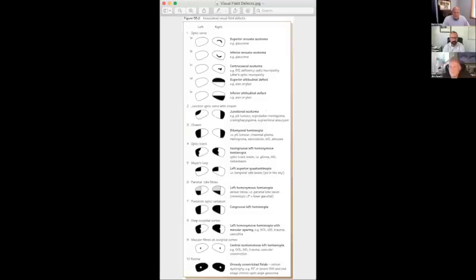Now, if we continue, the first one, like Dr. Fanelli said very well, most of the defects of the optic nerve are unilateral. It could be, of course, bilateral, but most of the time they are unilateral. But one thing to also keep in mind, especially if you're doing a 24-2, is that you might see a defect unilaterally on the 24-2, but you don't see it on the other eye, not because it doesn't exist, but because it is still very peripheral. And I'm sorry that I'm using the exception, but I think it's probably more important than actually repeating what we are looking at here.